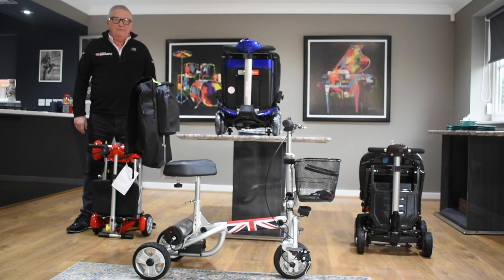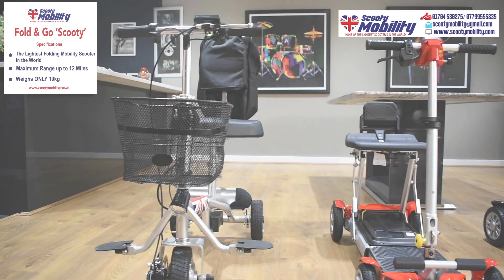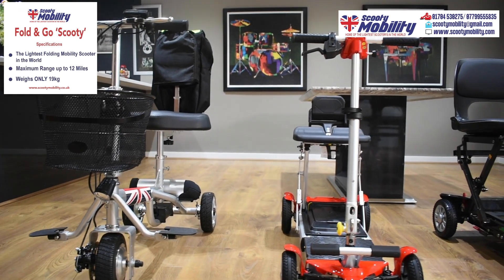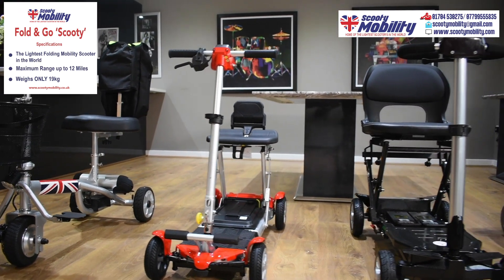Hi and welcome to our review. The scooter that we're about to see is the lightest scooter in the world at only 13 kilograms. It's unique to us and it's called the Scooty. We do sell a selection of other lightweight folding scooters as well and you'll find videos of those on our website.